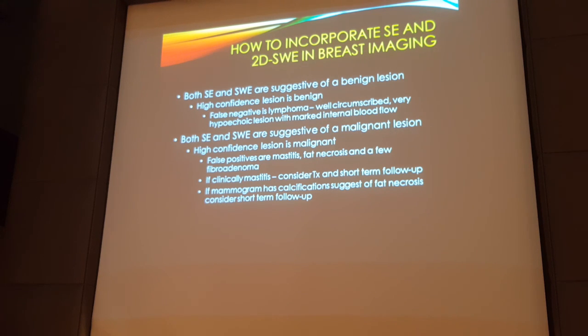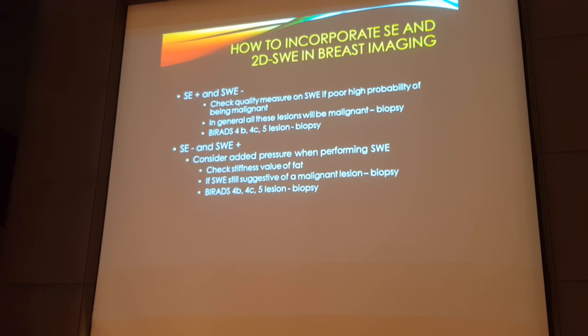So clinically, if the patient has mastitis, we would ask the referring doctor to treat them and then do a short-term follow-up to make sure it goes back to normal. And if we see calcification suggestive of fat necrosis on mammography in these patients, then we would also do short-term interval follow-up instead of biopsy. If strain is positive and shear wave is negative, again, we check the quality of the measurement on shear waves, and if it's poor quality, we consider it malignant. And in general, all these lesions will be biopsied.